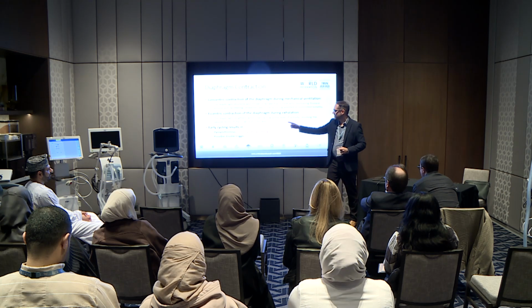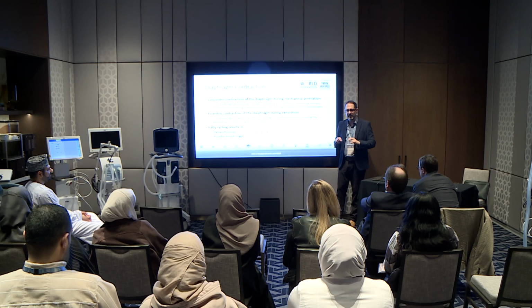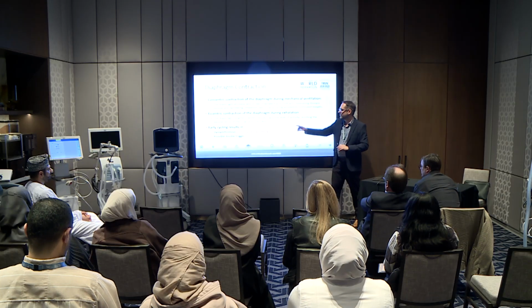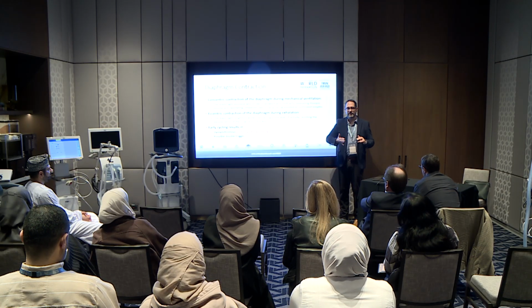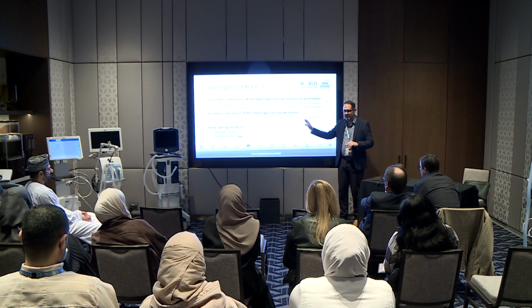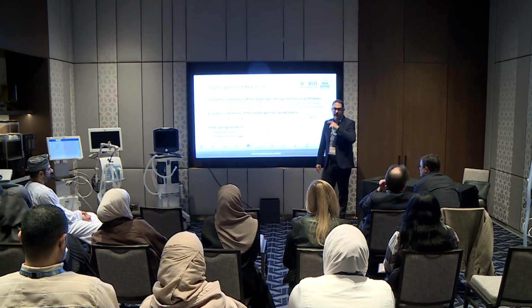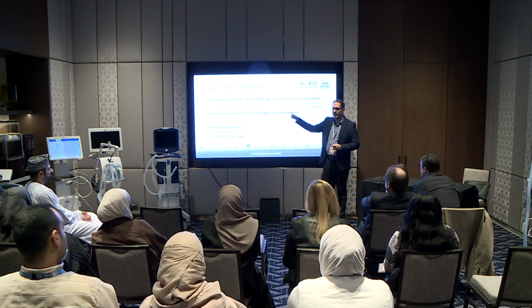But in some patients, they may maintain some level of activity. This can be called expiratory braking, which resists the passive recoil of the lung and the chest wall. But it also could simply be continued effort. With early cycling, the ventilator cycles off and they're still contracting. This is considered a form of eccentric contraction, but I clarify here because of a paper recently published by Ewan Gallagher and colleagues: when you have short cycling, it's a combination of the two.